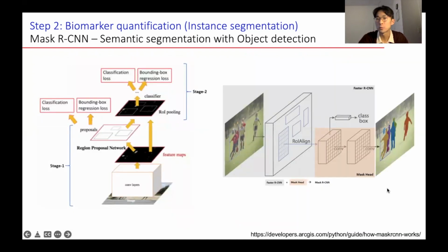And just to briefly describe how it works, there are 2 stages. The first stage, we would have a region proposal network, my apologies, where basically it would draw different size regions, such as these rectangles over here. And within the regions, there would be different masks or different objects that would be identified and labeled. And in this case, you have these children with different colors. And so essentially, it's taking the CNN with various regions of interest. And so we're able to identify each local image or local object.